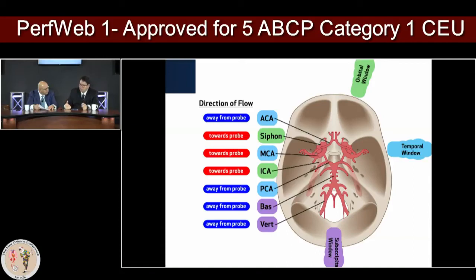And I think those are the really easy confirmation that if you really fix the flap and that dissection is fixed, you will see the improvement of the flow right away. Or let's say that the dissection is progressing and the left side was not affected, but during the surgery, something happens that you see the dissection progressing too. So I think it's stunning that a live monitoring of the blood flow tells us if the origin of those carotids are affected. We do provide monitoring in all our TAVR cases.